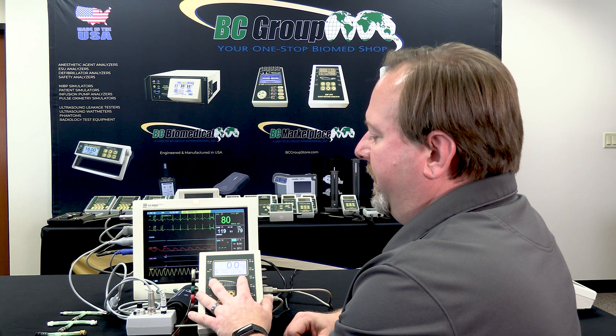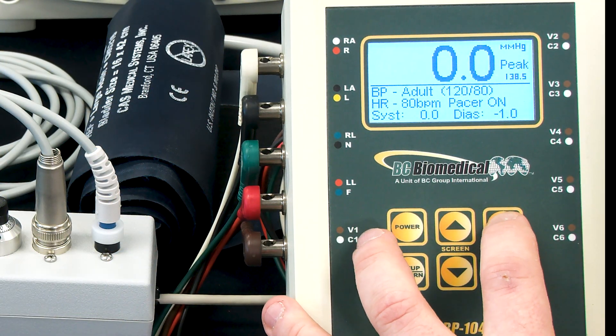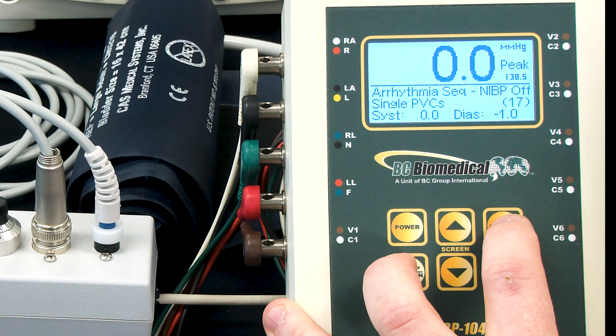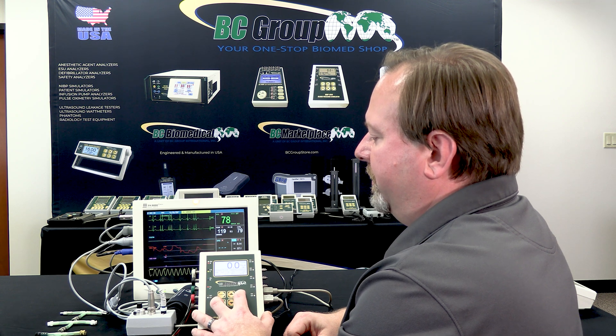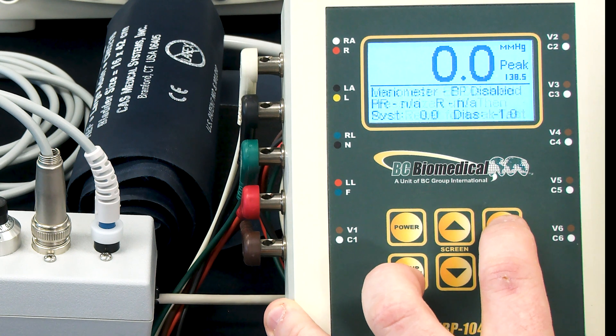By default, the NABP 1040 will power up to display the normal 120 over 80 blood pressure simulation. The different simulations can be selected using the select key, and we'll see quite a few options regarding alarm mode, arrhythmia sequences, and leak test.